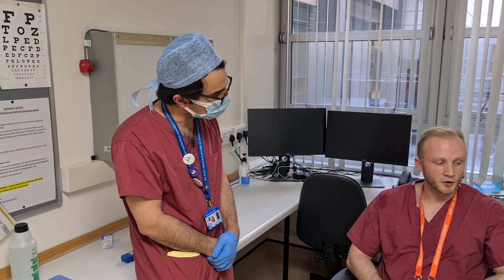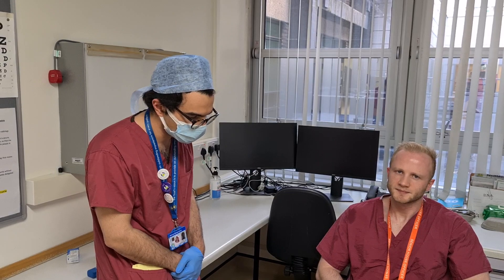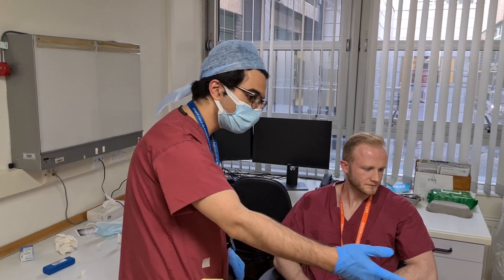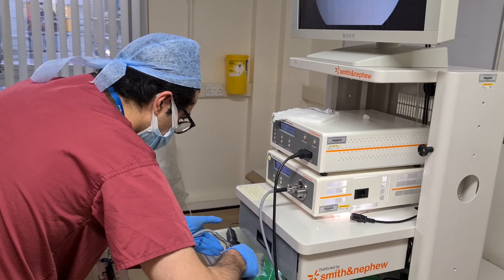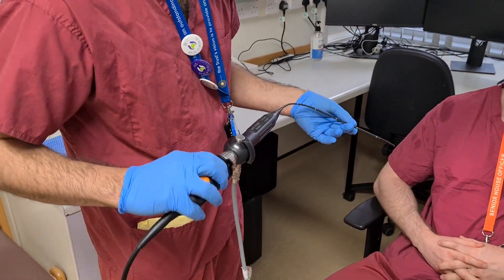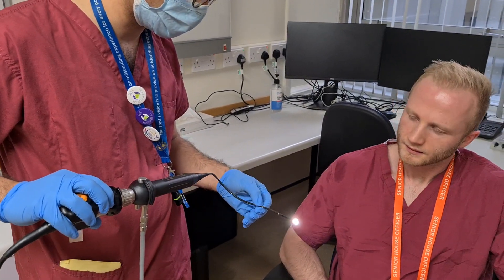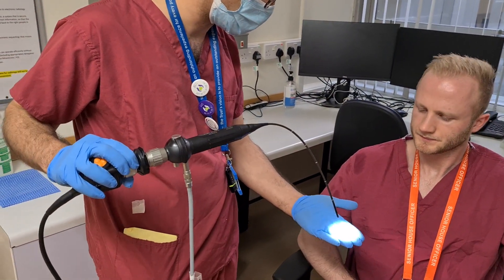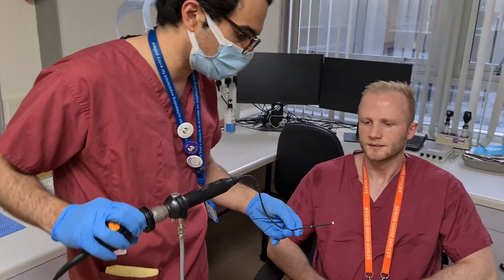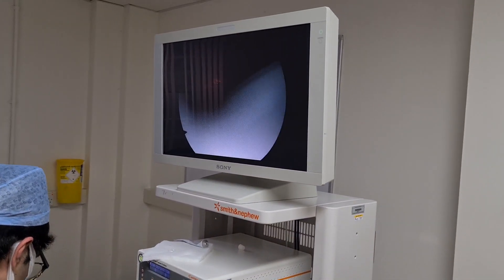So broadly, we're going to use this camera here. It looks a little bit long but that's just to make it easier for me to use. It's a fibre optic camera and it's got a light source. It just allows me to have a look at the TV there so we can see what is going on with your vocal cords. Would that be alright with you? Fantastic.